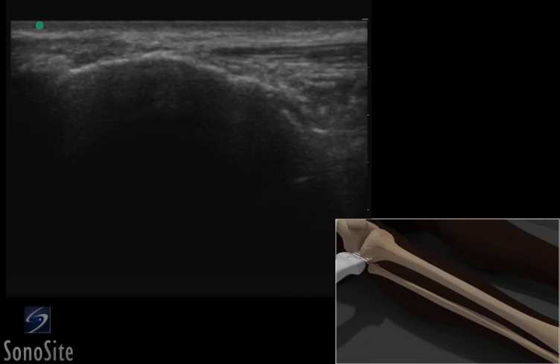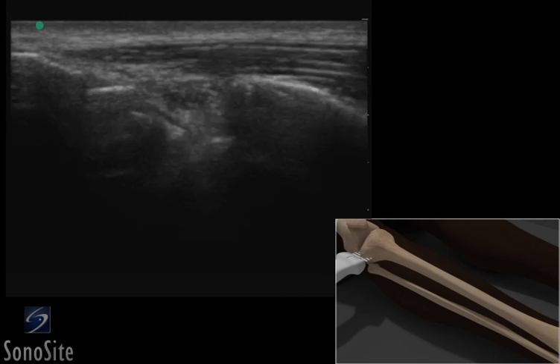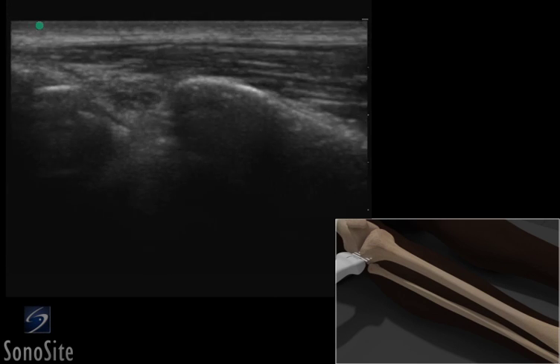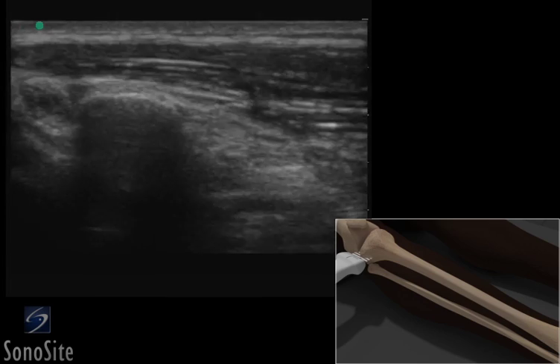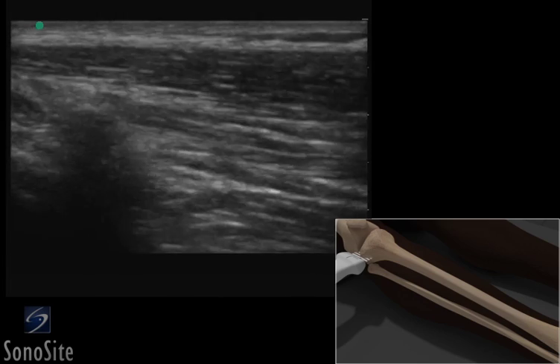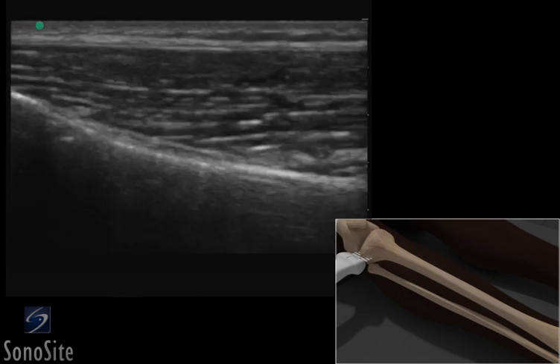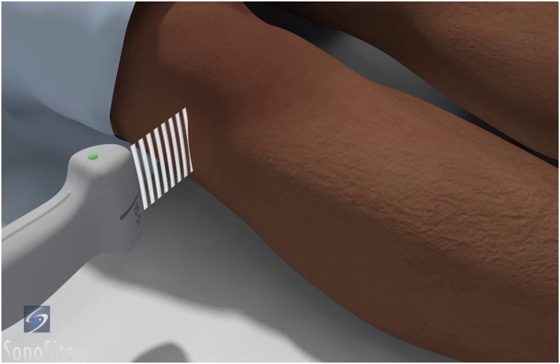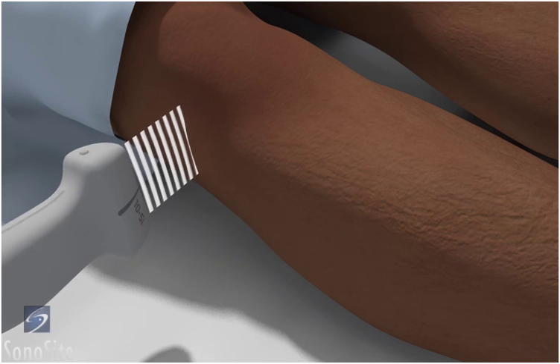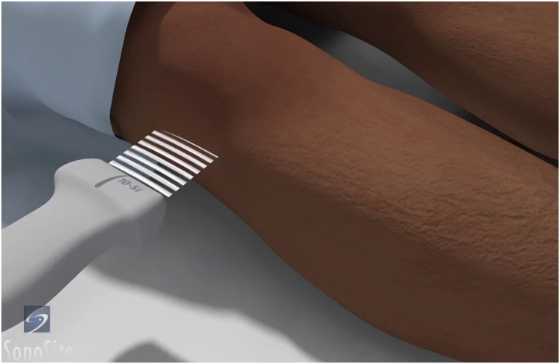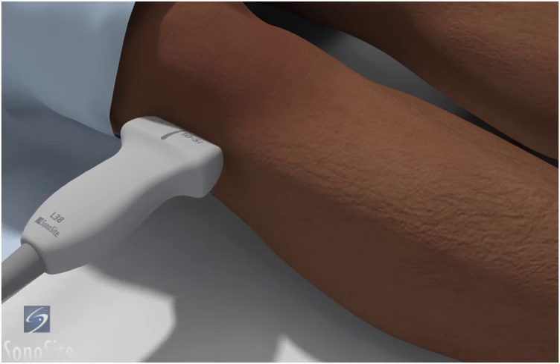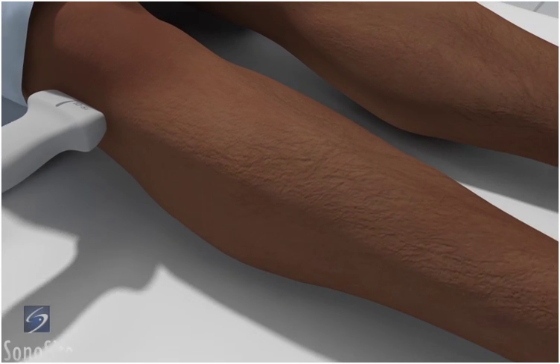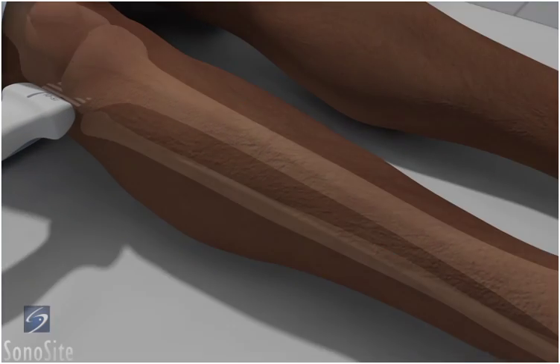A linear array transducer with a musculoskeletal exam type is used to perform an ultrasound examination of the tibia. The patient is in a supine position. The transducer is placed longitudinally over the lateral joint line with the orientation marker directed to the patient's head.